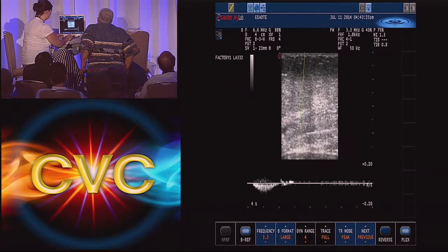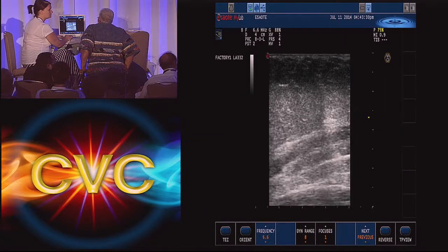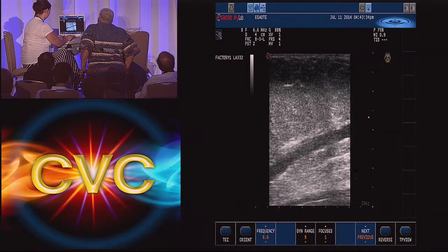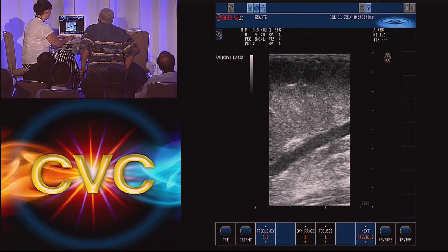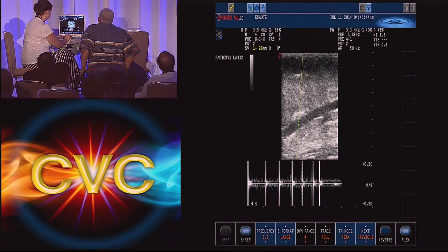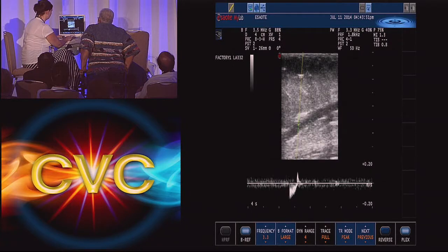So this one shows almost no reflux. Well, she's been sitting in the coldest room. Absolutely, there you go. But I'm glad you're seeing this now, because there are enough textbooks that'll show you all. This is real life. So you have somebody who comes in your office, you look at them, and you see there's a problem, and then your ultrasound's not showing it. So this is what we do. I'll bring her back another time. I'll come in the room myself, we'll sit down, explain to the patient, and then go from there.